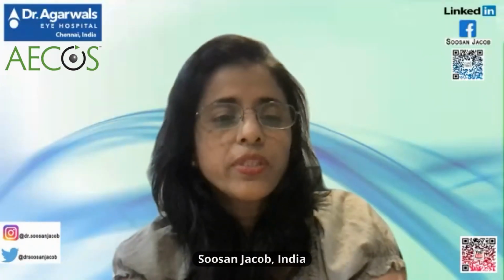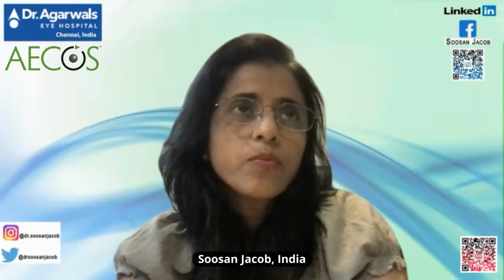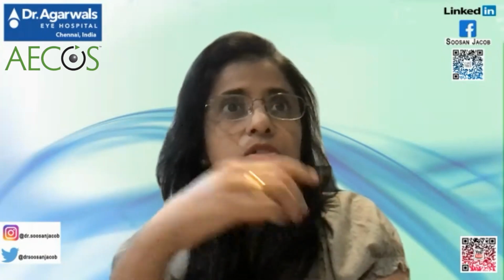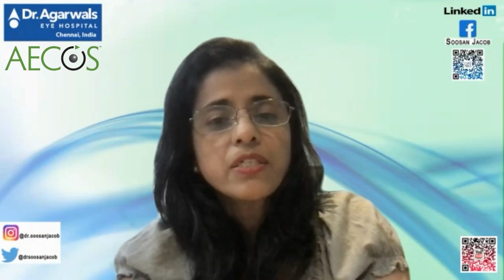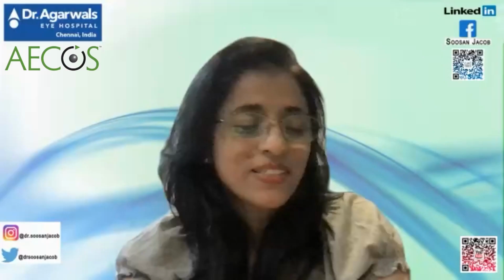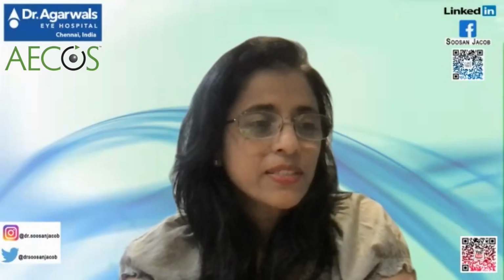Yeah, that's a great question, Pavel. And yes, I have tried cross-linking it and then putting it in. But I really don't think it makes that much of a difference, because cross-linking is not going to give you that amount of stiffening, as you saw with Sherry's technique of just dehydrating it. It just becomes so much easier. It's literally beautiful, and he calls it the jerky technique. So you can just push it in like that. So that's a great thing.